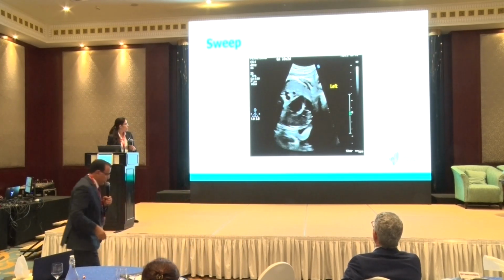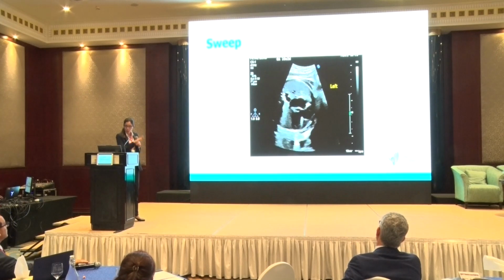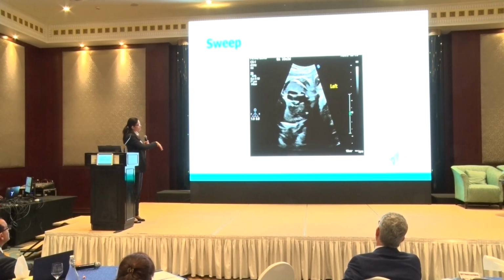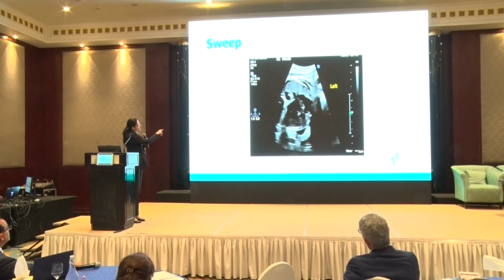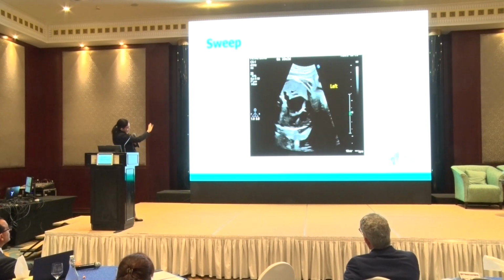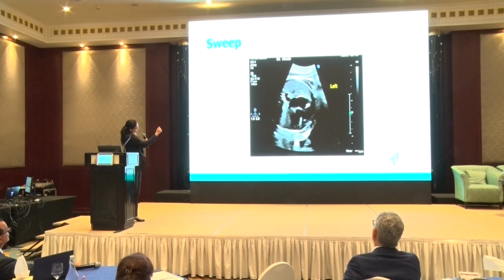Yeah, you can proceed. Okay, so this one, I have this clip, but it's a sweep, so we should be able to get a lot of information. So the fetal, so the baby, that's the left of the baby. Now, first thing, if you look at the four chamber at the beginning, stop there. Let me try to freeze it there, okay? So you can see the heart is more on to the right, isn't it?